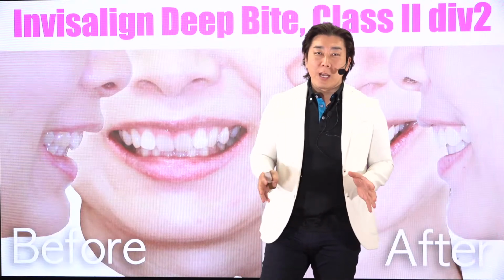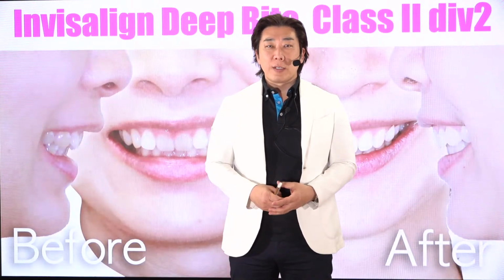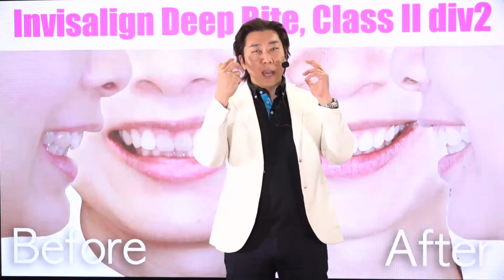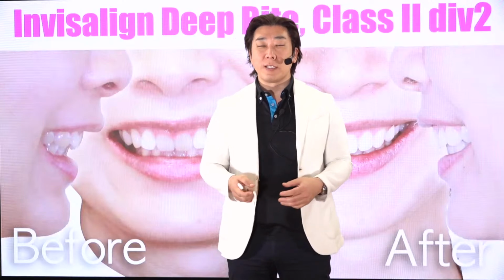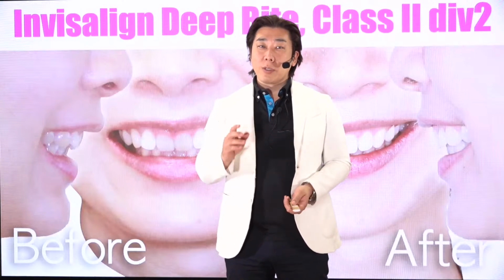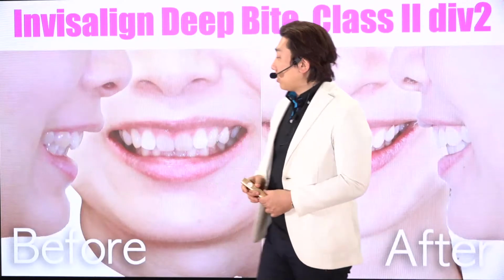Many types of class 2 are there. Some of the time, class 2 is very easy to treat with upper molar distalization. Some of the time it is extraction. Many solutions are there, but one of the approaches is class 2 division 2 like this.